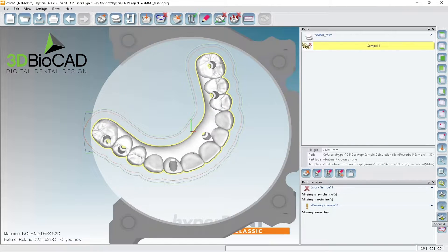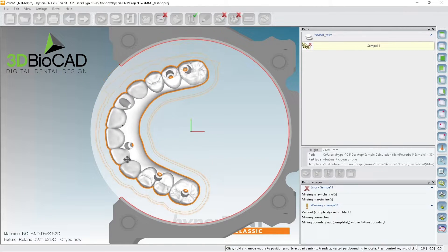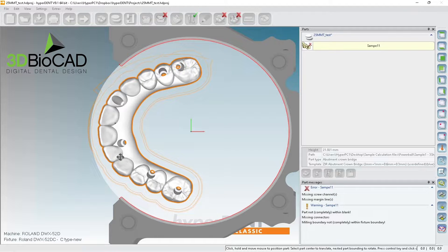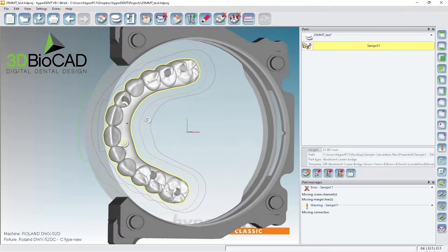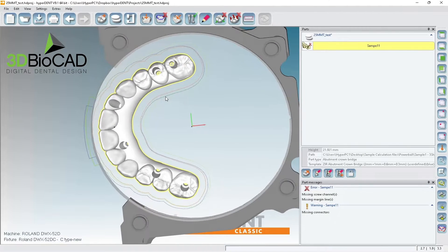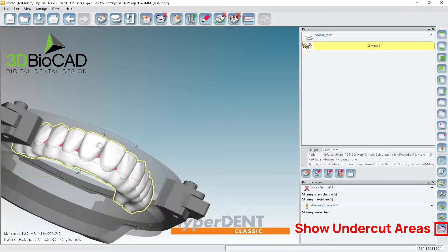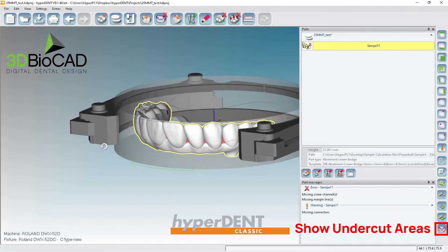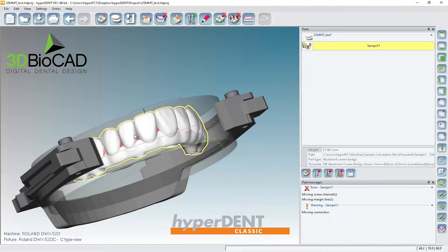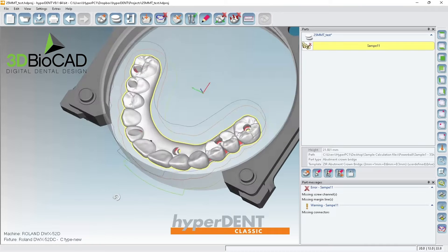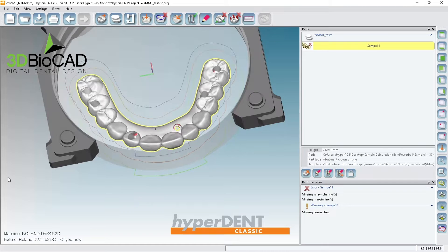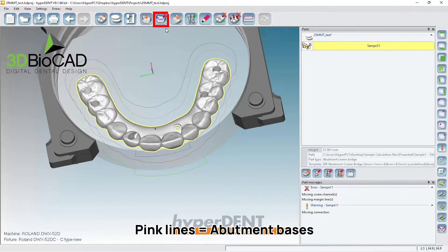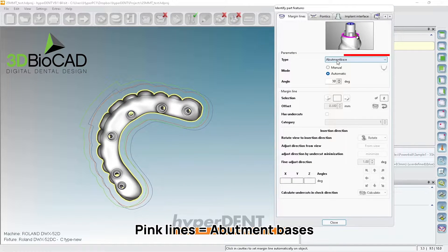And I'm going to rotate, bring it all the way out because it has undercuts and whatnot. Let's look at the undercuts. This one, the design has very, very minor undercuts. If it's this minor, then I don't think we have to do user defines. But just for learning purposes, I want to show you. First, we want to have the pink lines, which is called Abutment bases.